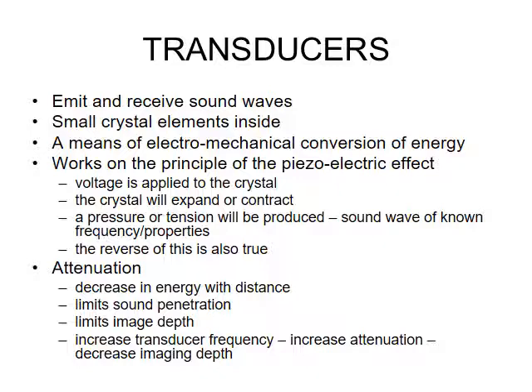Now, why are we having to make these changes? It's because the body is attenuating the ultrasound, the sound wave. It's being absorbed, some of it's being scattered, and not all of it is being transmitted and sent back as the echo.